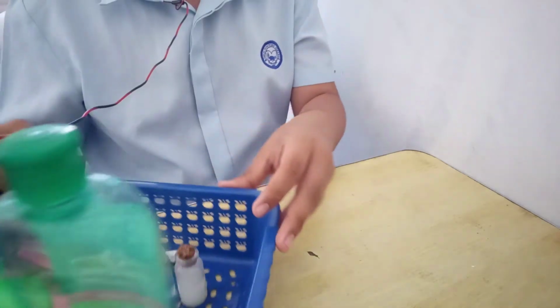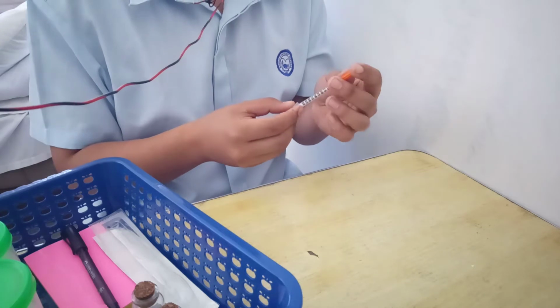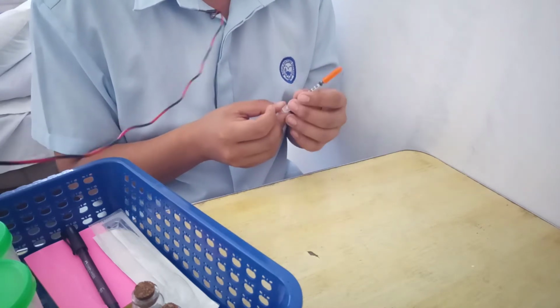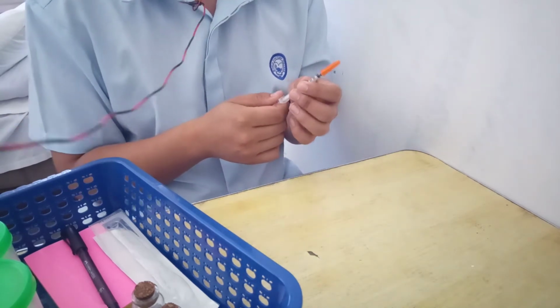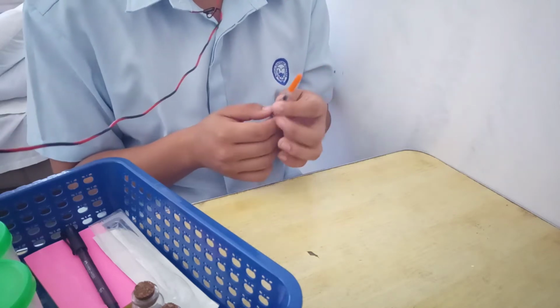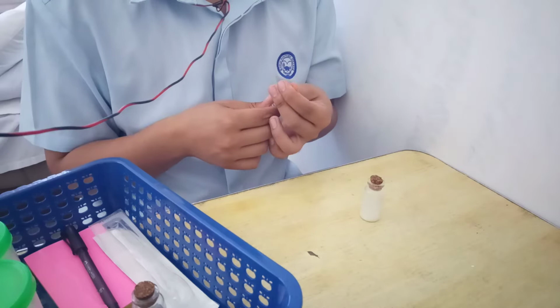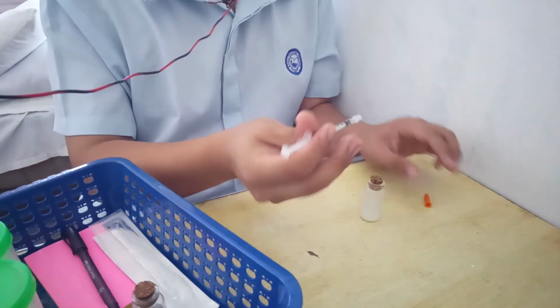After that, we must go to the syringe. Withdraw or draw the required amount of air which is equal to the required dosage of cloudy insulin for the patient. So let's say for the cloudy insulin, we have 10 units. So we withdraw 10 units of air. After withdrawing 10 units of air, hold the cloudy insulin on a flat surface. After putting it, inject the air into the cloudy insulin vial. Make sure do not draw any insulin.